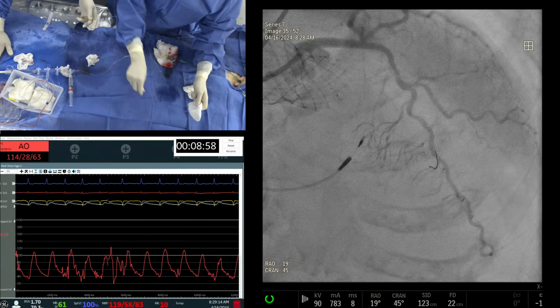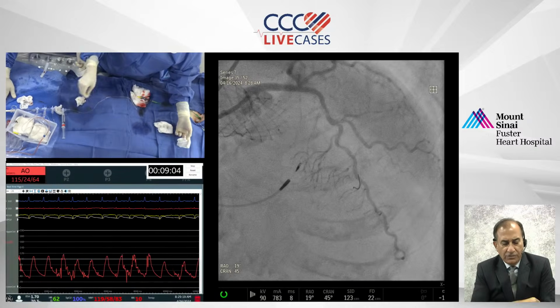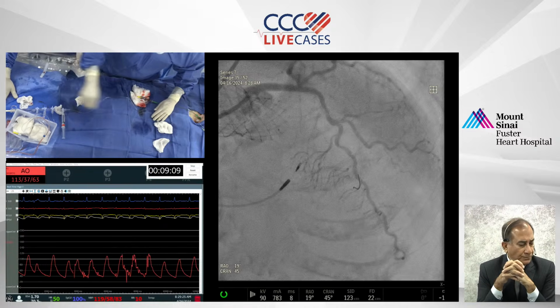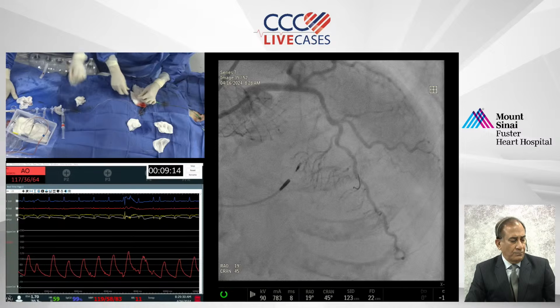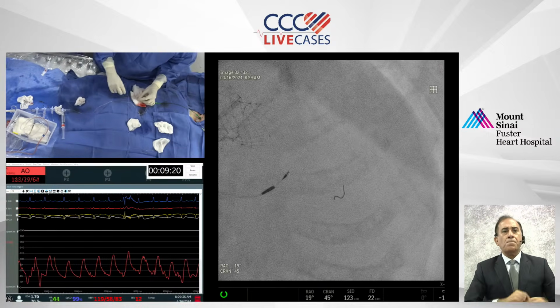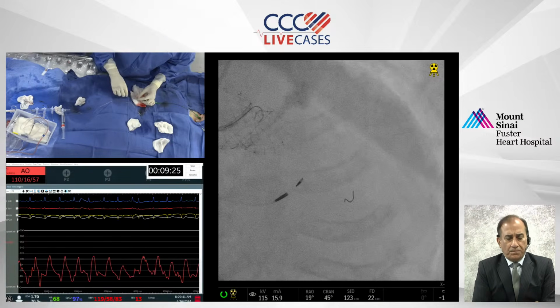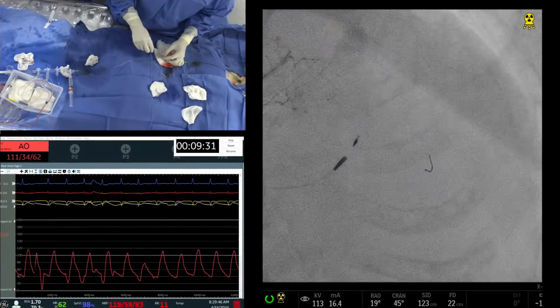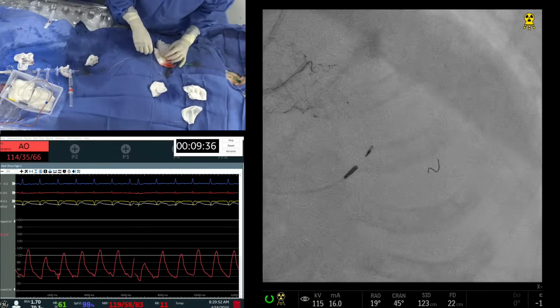Samin, another question from Dr. Rice: is there concern of impairing collateral flow to the RCA with rotablator? That is absolutely a very good point. The data have shown, particularly with septals giving collaterals after LAD intervention with a totally occluded RCA, despite good normal function, they become stunned in the inferior wall. The whole purpose is that you do your rotational atherectomy correctly, and that should normalize after the procedure is done. But yes, sometimes it can give trouble and can last for some time.